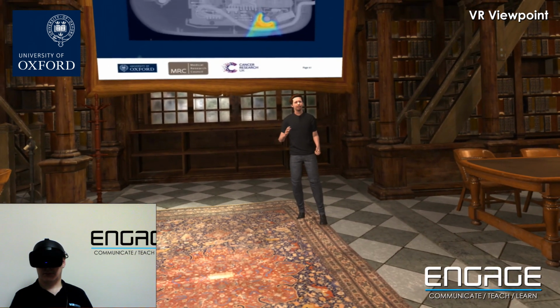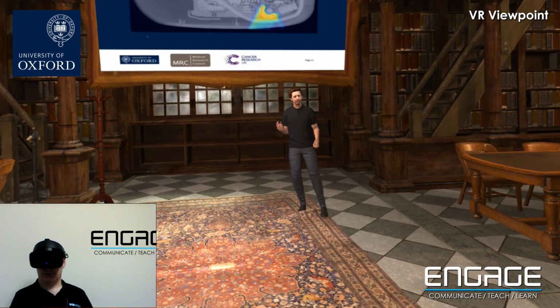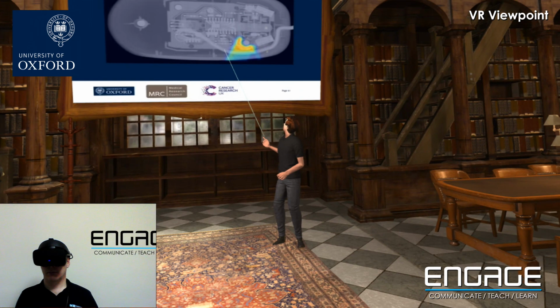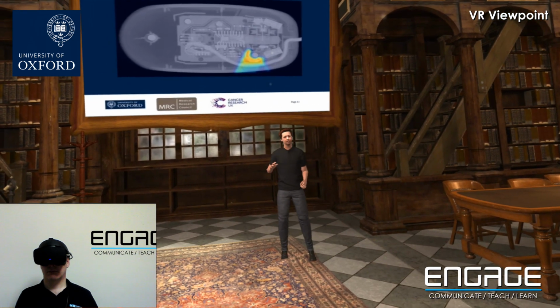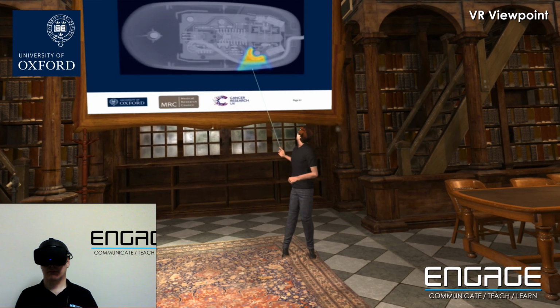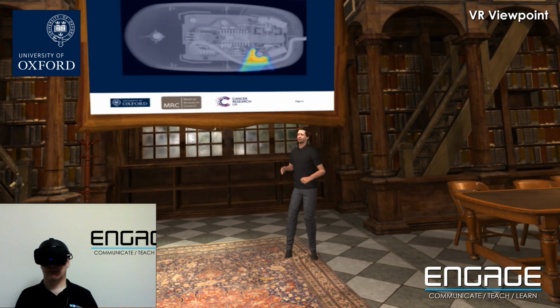We've got really quite good doses in the tumor, a little bit of high dose just outside it, but now for the first time we're seeing reasonable sparing of this circular organ. We're seeing some sparing of the lead that comes out to the computer. This is a really nice solution.